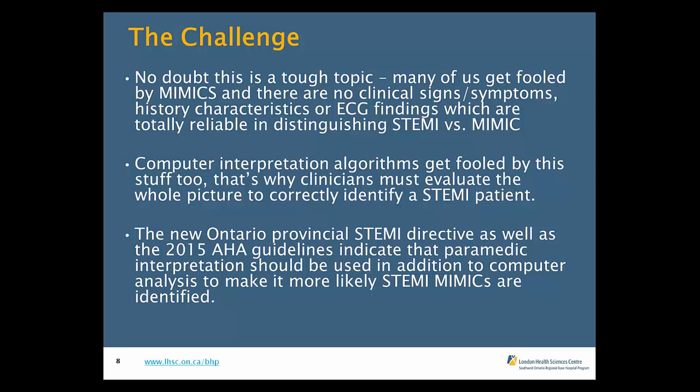So even though you may be the primary attendant on a particular call, it's very much appropriate, and I would say should become the expectation that you review that ECG together, and that gives two different perspectives and hopefully has the option of mitigating against some of the distractions that might steer you in the wrong direction. As with most things, two sets of eyes is going to be better than one.